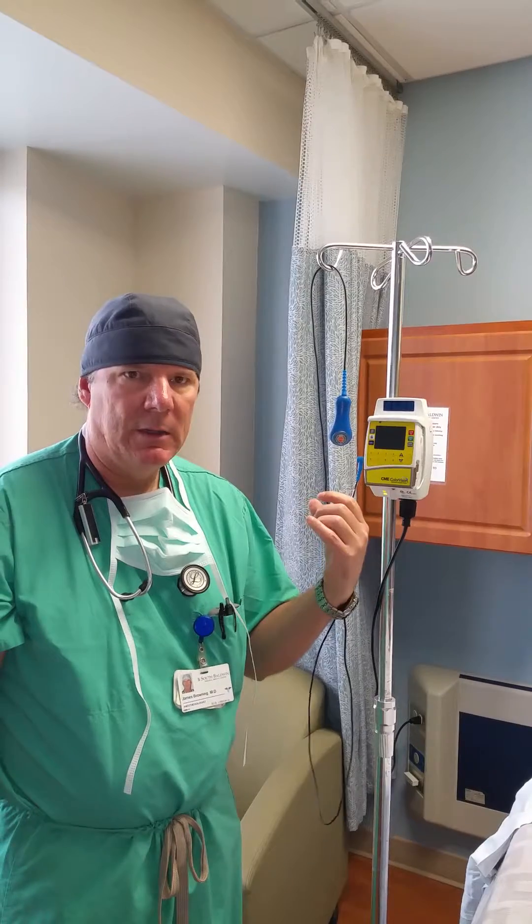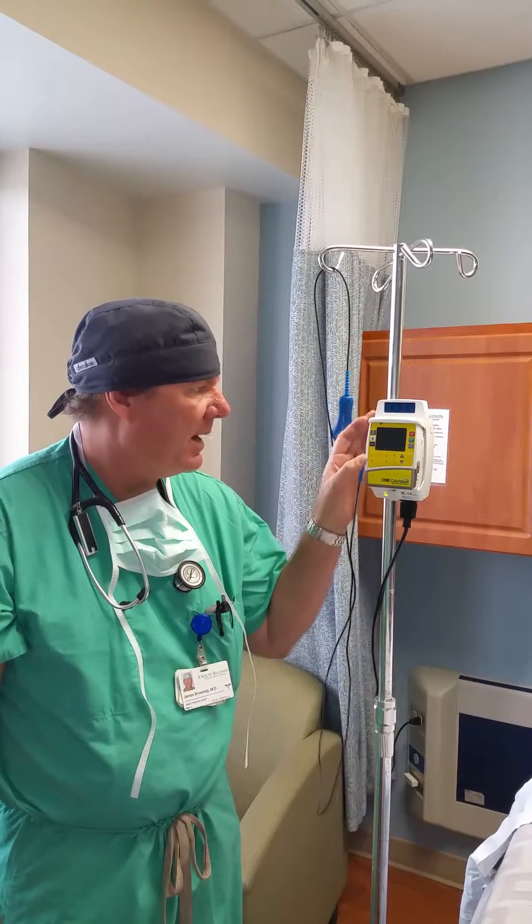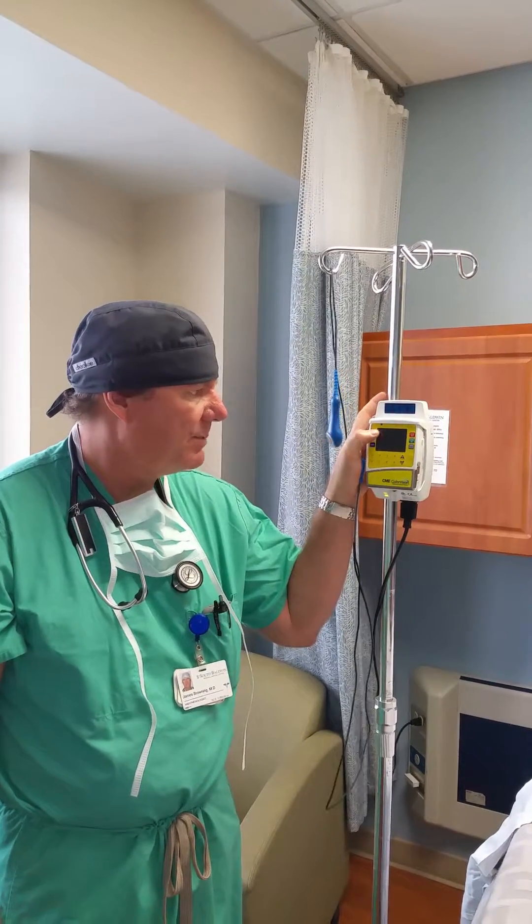So it's programmable. It can be shut off by the nursing staff just by pressing the off button, and then we can come and adjust it. They do that sometimes when the patient is numb to where they can't feel their contractions at all and need to be able to push. They'll knock it off for 30 minutes or an hour, and that lets it wear back to the point where they can start feeling contractions and help push.